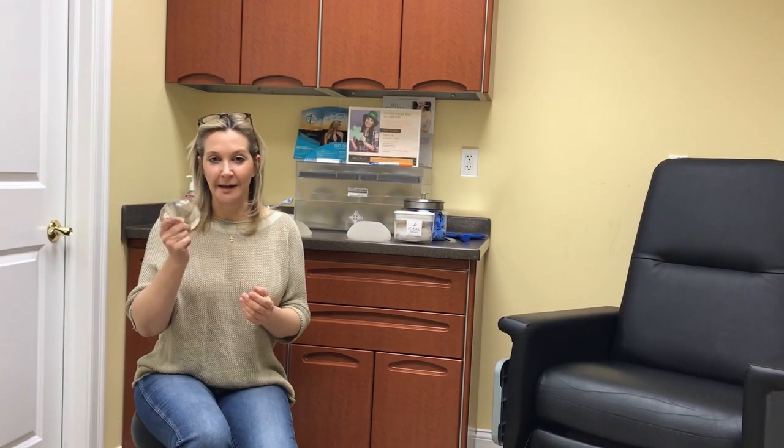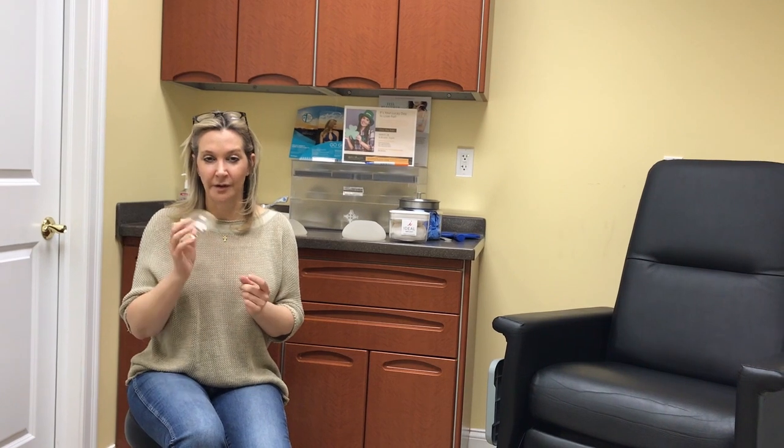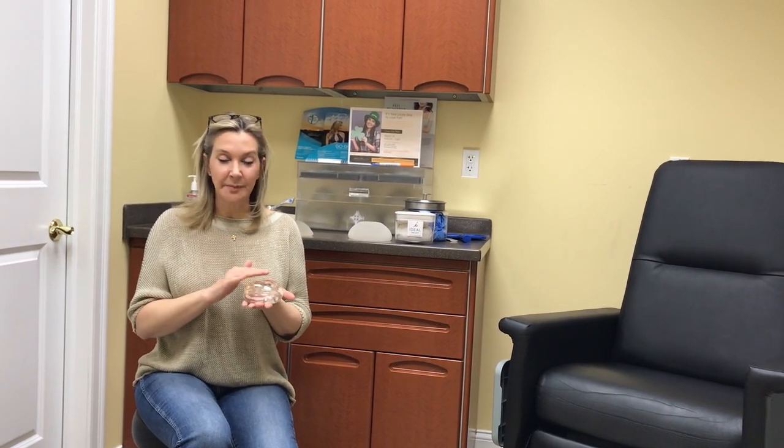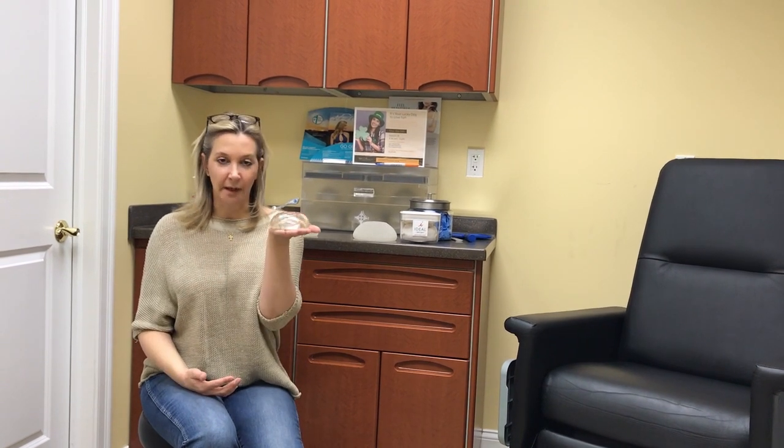So you may ask why people would decide on doing a saline implant ever. And to me, there's really one good reason for it, but I can tell you my bias is usually to recommend the gel implants because they are far superior. Why I say they're superior is because, number one, they're optimally filled in the factory. So when we get this in the operating room, it comes just like this and we put it in.